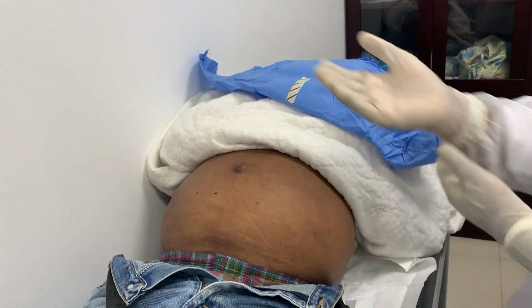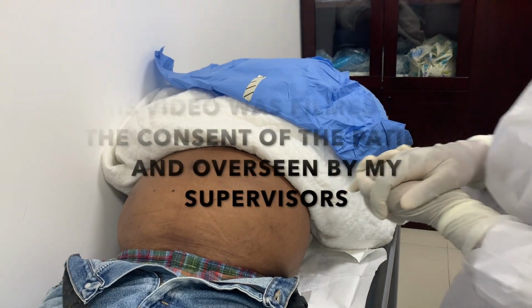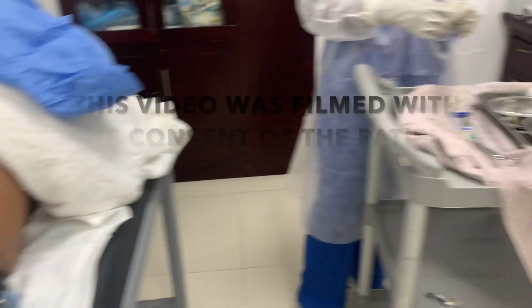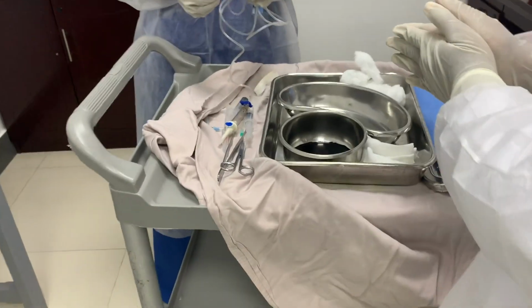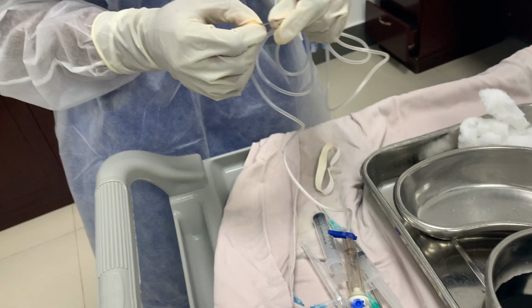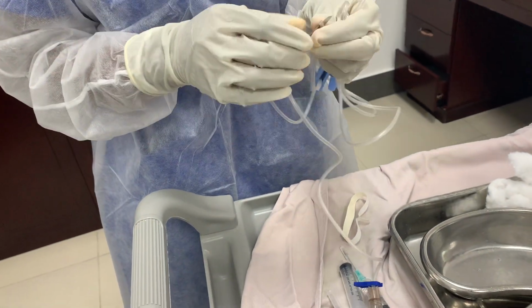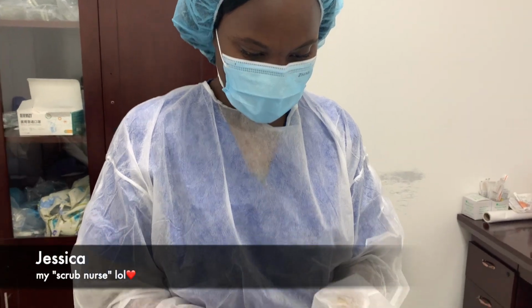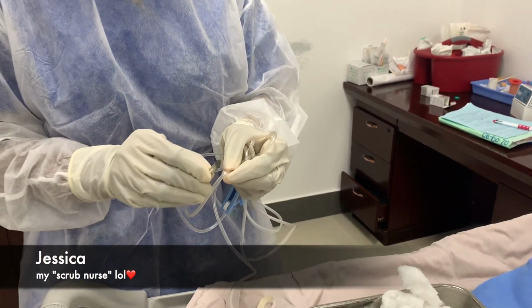So this is my surface area of work for today. This is my assistant for the day, Jessica.